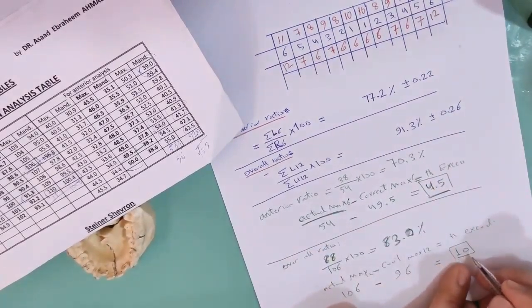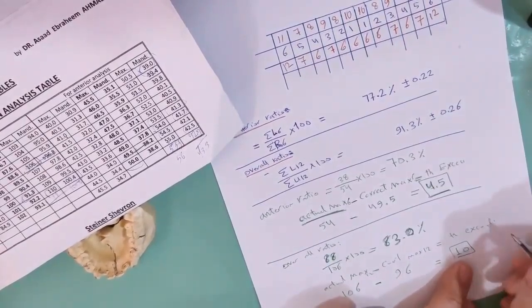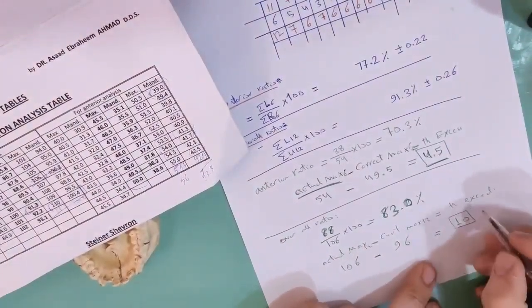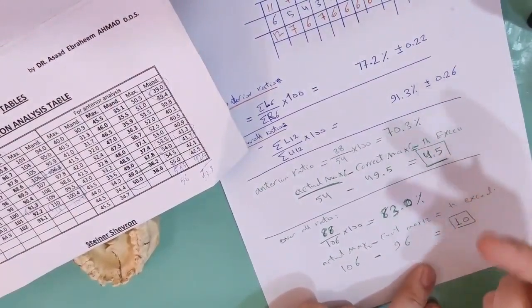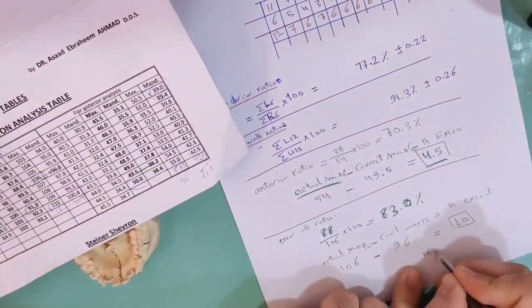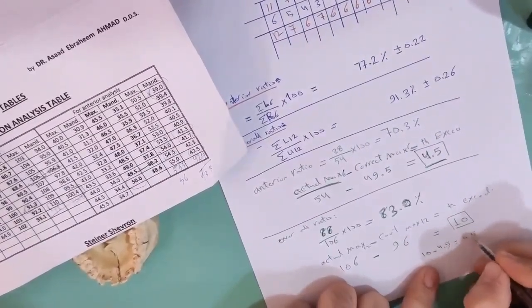If we need to know how much excess volume there is in the buccal section, from first premolar, second premolar and molar, for the two sides, we just do 10 minus 4.5 equals 5.5.